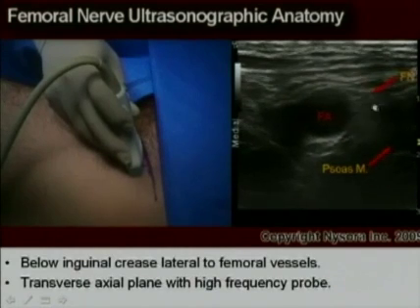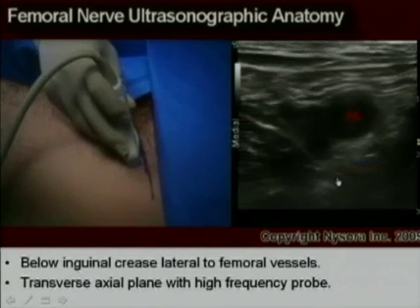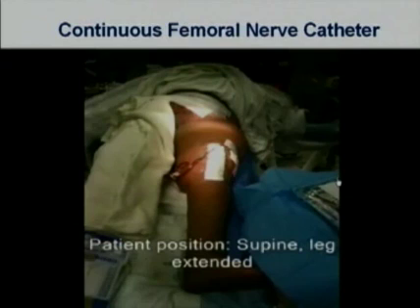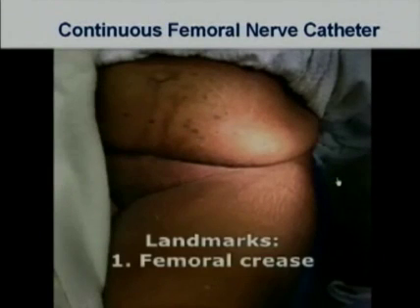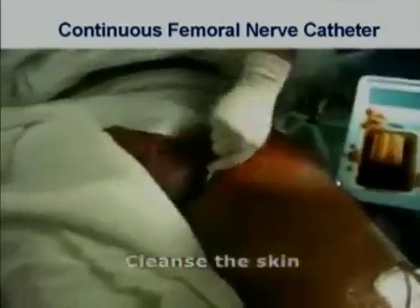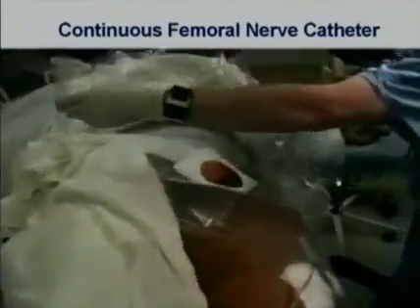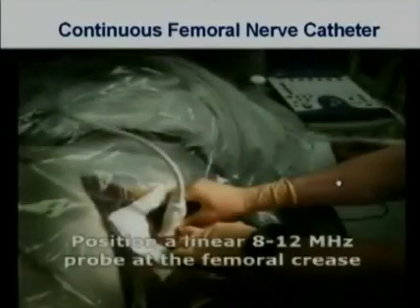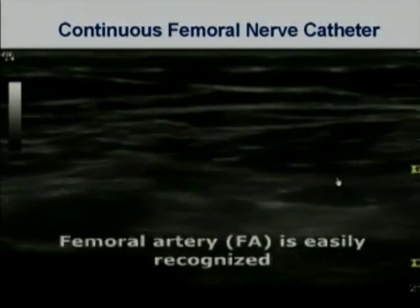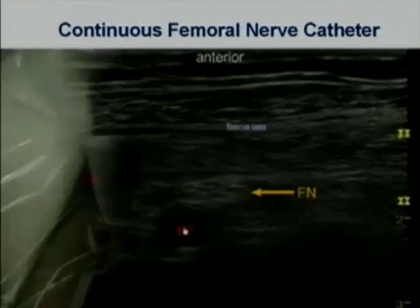The femoral artery is identified, and the femoral nerve is a large, hyperechoic, bright structure — a large nerve, easy to identify so that a nerve block can be performed at that location. This is a video of a continuous femoral nerve catheter that we often do for post-op pain relief after knee surgeries. All catheters should be done in a sterile fashion. We typically apply a plastic drape as well as a sterile sleeve on the ultrasound probe. A linear probe is often enough to identify the femoral nerve, depending on patient anatomy, and can be visualized above the profundus branch of the femoral artery.